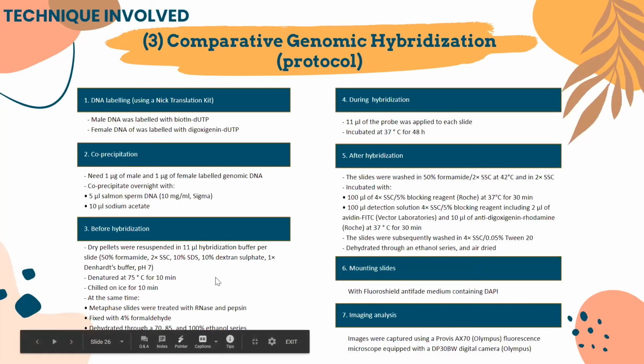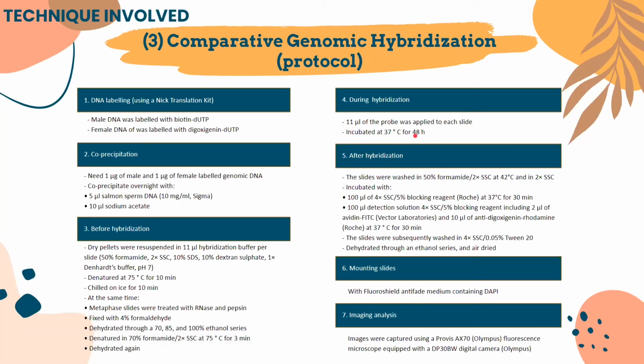But at the same time, the metaphase slides were treated with RNase and pepsin, then fixed with formaldehyde, dehydrated, denatured, and dehydrated again. Next, we do the hybridization. The probe was applied to each slide, and then we incubate for 48 hours.